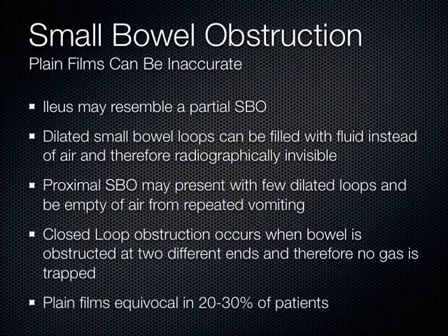Now, small bowel obstructions, you typically think about, in medicine we say the patient's got a small bowel obstruction, get an x-ray and you'll see it on the x-ray. Unfortunately, an x-ray needs to see an air fluid level.